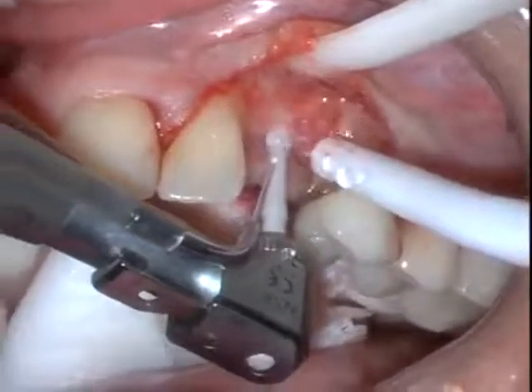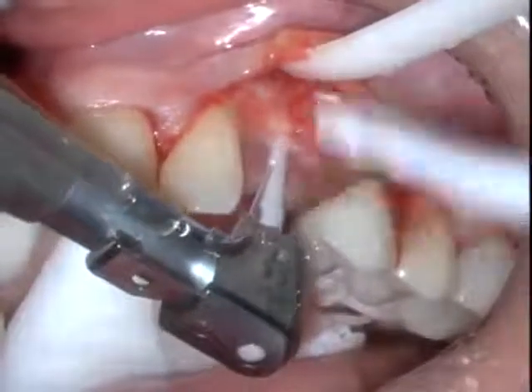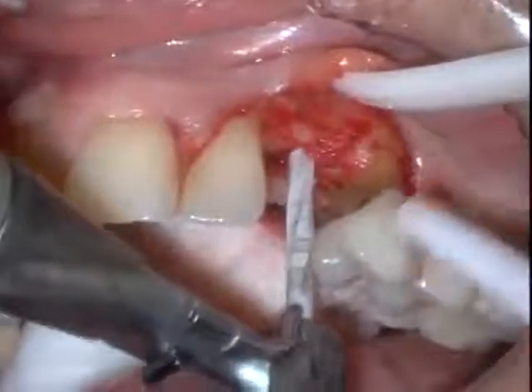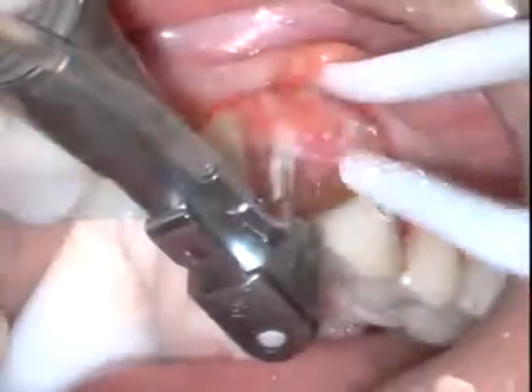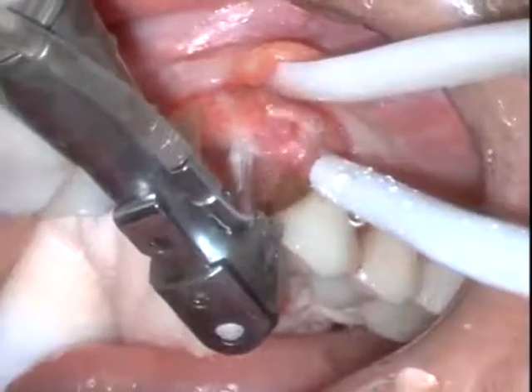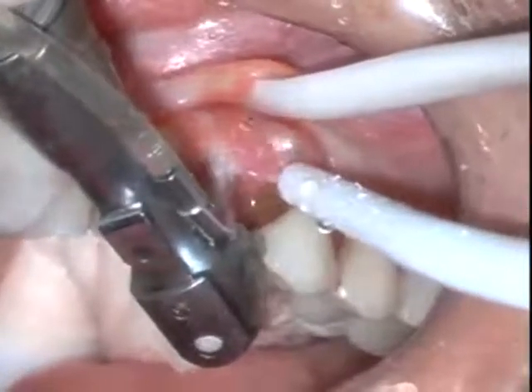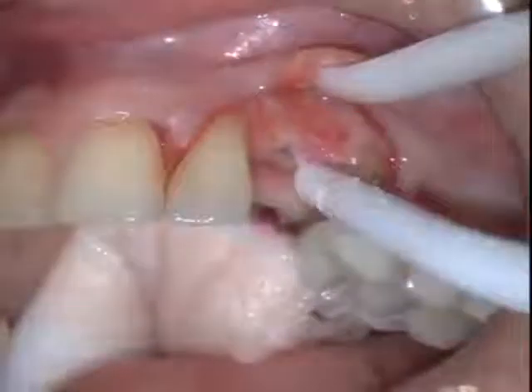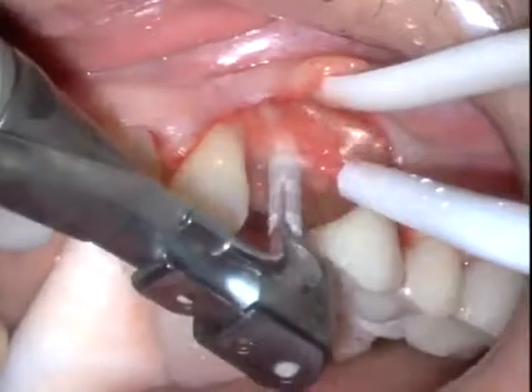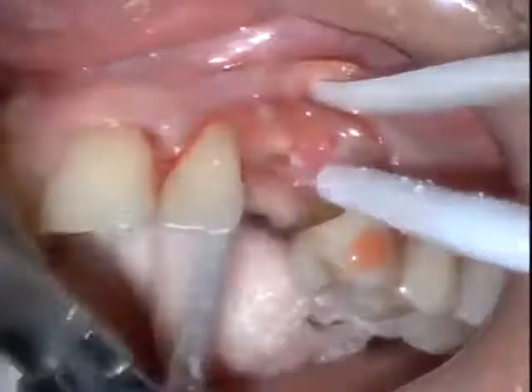The initial round burr was utilized to locate the precise mesial, distal, and buccal lingual position of the future zirconium implant. Z Systems offers us the option of zirconium drills as well as zirconium instrumentation so that the entire process can be performed without the utilization of any metallic instrumentation. Once again, for many of our patients, this is quite important. The twist drills, again, made of zirconium, cut extremely well, allow us to instrument the area with sharp cutting surface, and the drills perform extremely well, as you can see on the video.